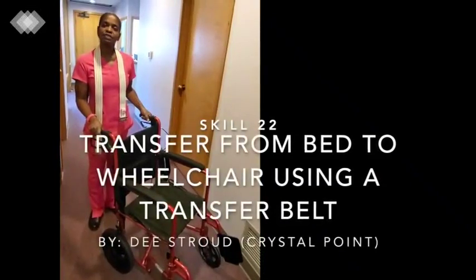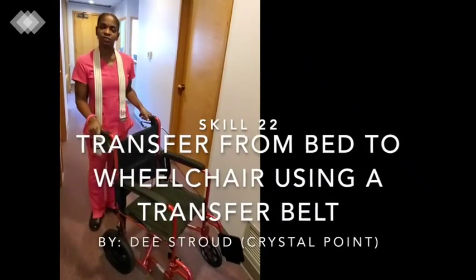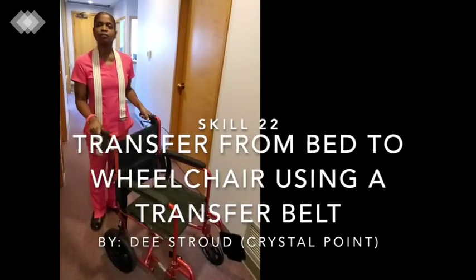I am now going to demonstrate skill number 22, Transfers Patient from Bed to Wheelchair.